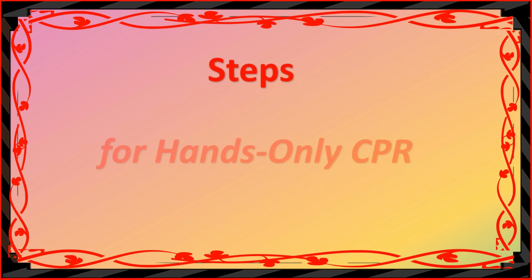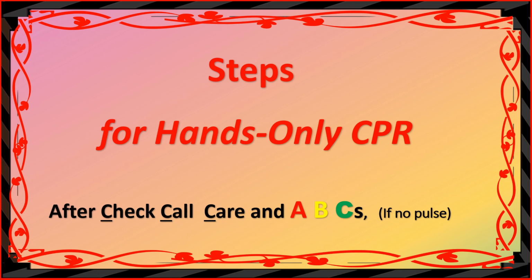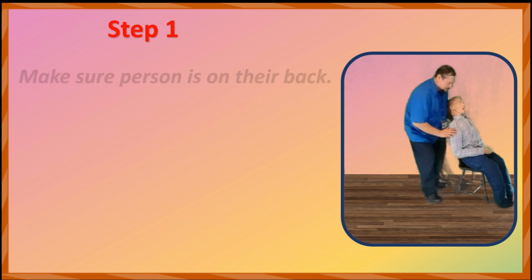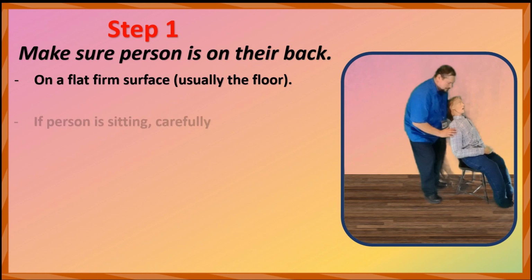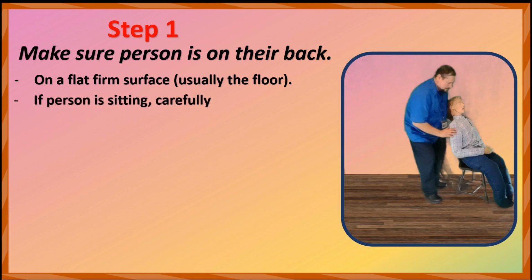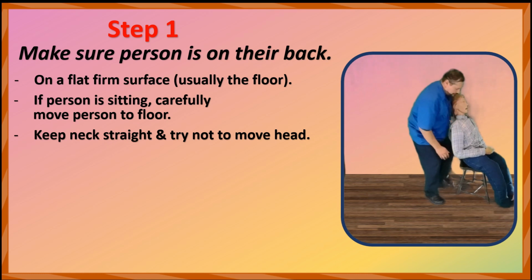Steps for hands-only CPR. After check, call, care, and ABCs, if no pulse: Step 1. Make sure the person is on their back, on a flat, firm surface, usually the floor. If the person is sitting, carefully move the person to the floor. Keep the neck straight and try not to move the head.